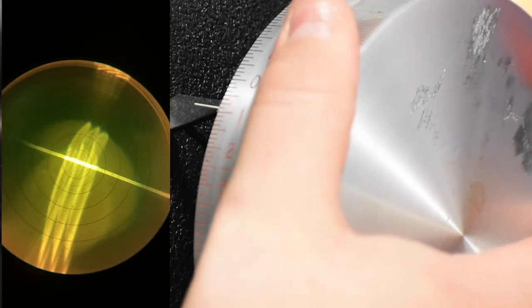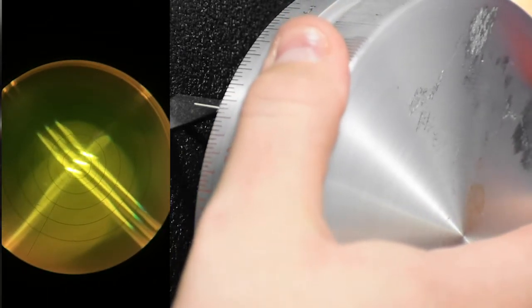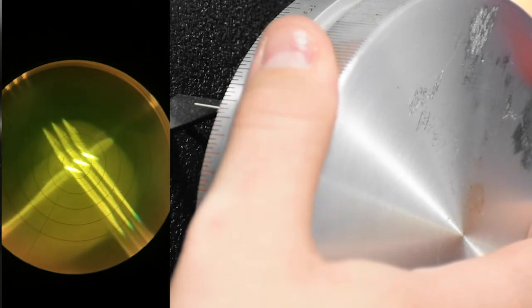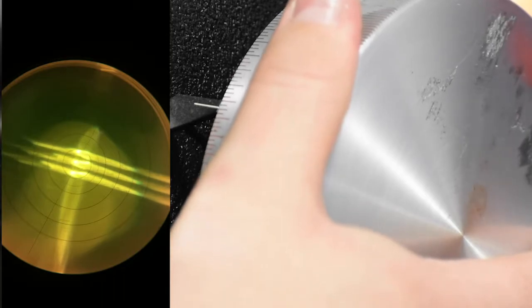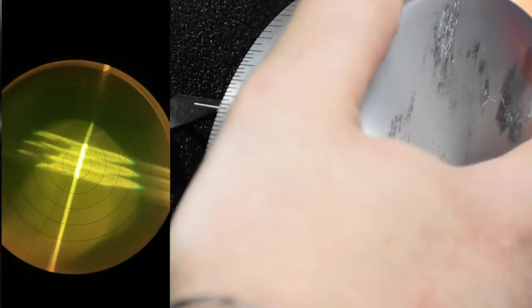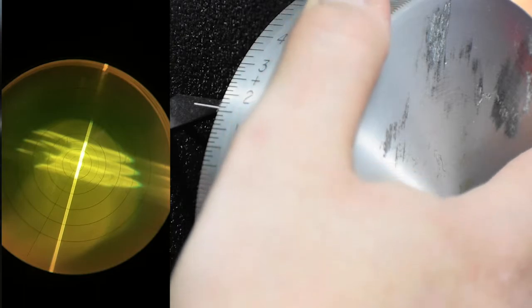So that looks like it's getting more focus there. Let's see here. And you can kind of see that there's three little lines, and as we move the axis drum, you see those lines kind of move. So you want those actually aligned with the three big lines, right about there. And then we want to, again, we talked about getting the three thin lines first. And you can kind of see those same lines are there too. See them moving there, right there, good.